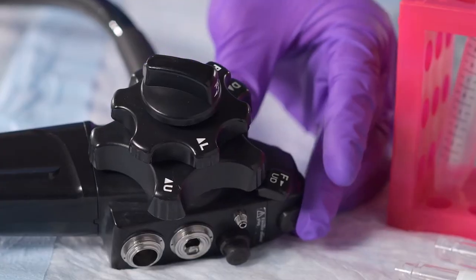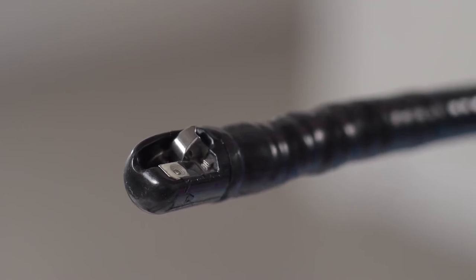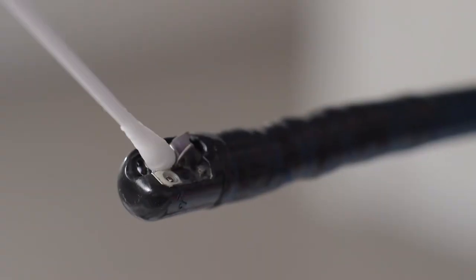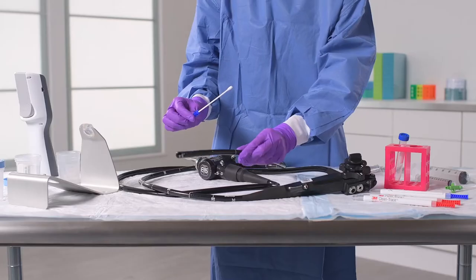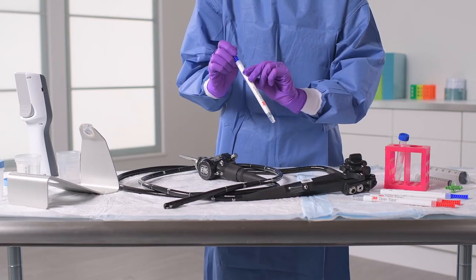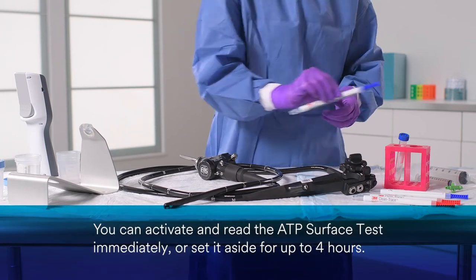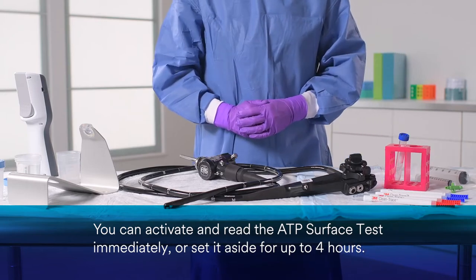Then, turn the control knob so that the elevator mechanism is now in the full up position. Using the same surface test, swab the exposed parts of the elevator mechanism and the recessed housing. Once you've collected this sample, insert the test back into the device sleeve. You can activate and read immediately, or you can wait until the next steps are complete. You have up to four hours to activate and read this test.